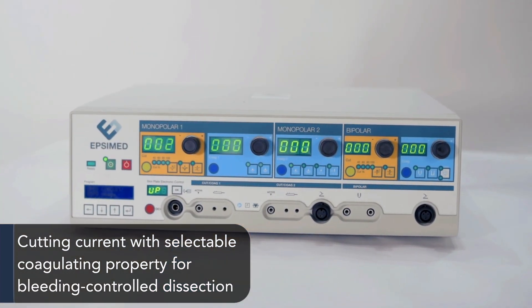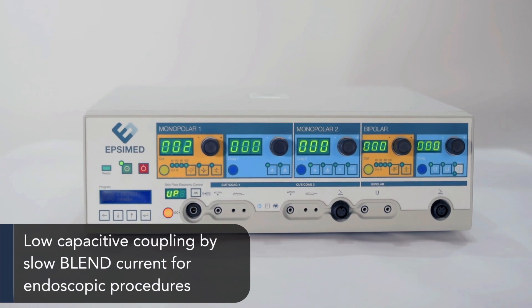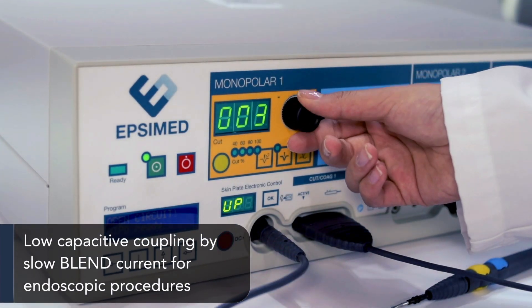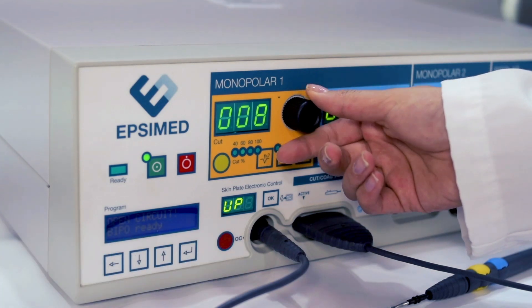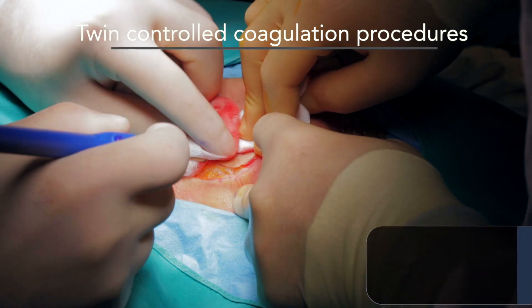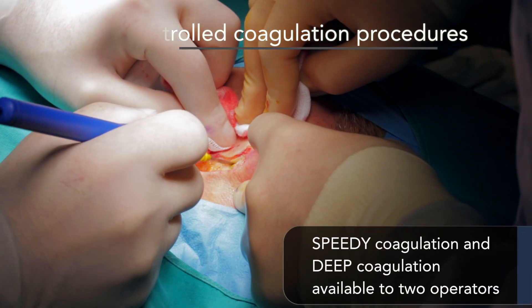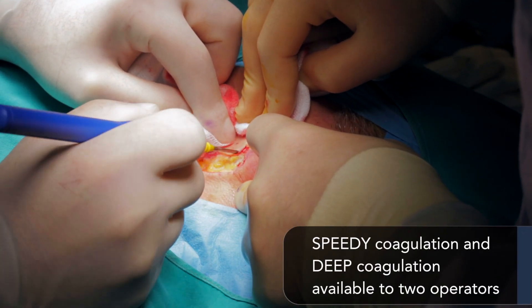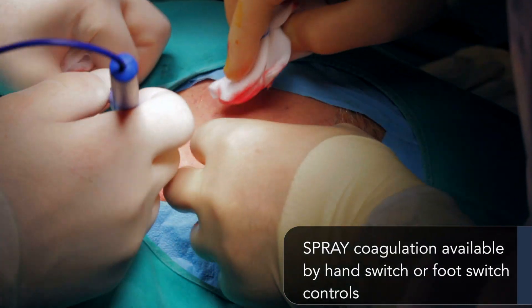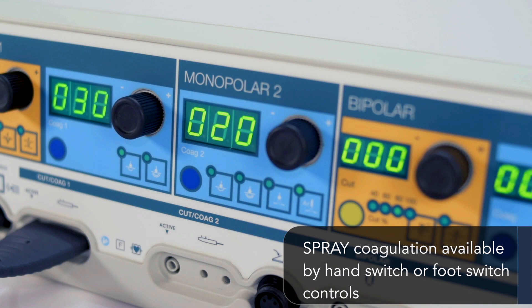Features include bleeding control dissection, low capacitive coupling by slow blend current for endoscopic procedures. Twin controlled coagulation procedures include speedy coagulation and deep coagulation available for two operators, and spray coagulation available by hand switch or foot switch controls.